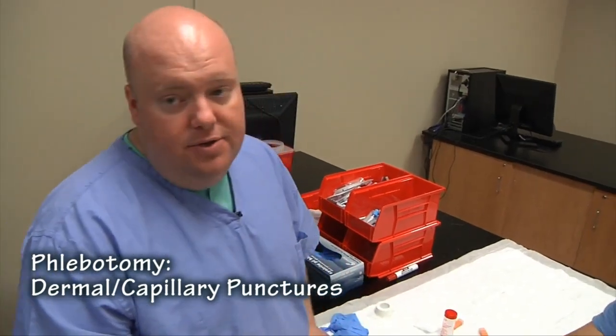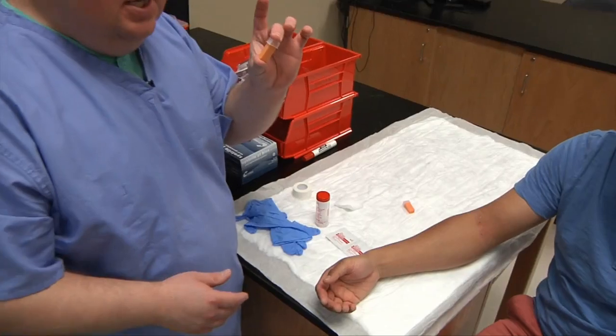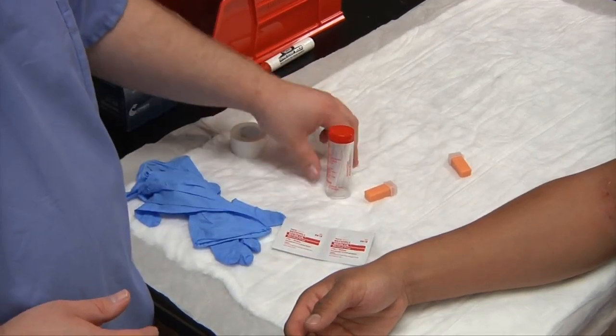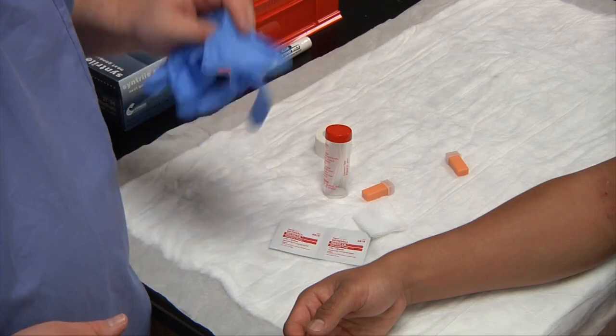Today we're going to learn how to do the dermal puncture on each other. The equipment you'll need is a lancet, your capillary tubes, alcohol swabs, your 2x2 gauze, you might need some tape, and you also need your gloves.